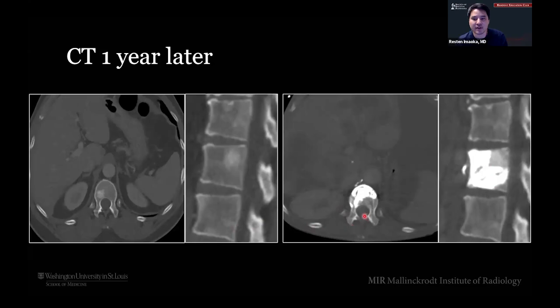So you can see 1 year later, he did absolutely fine. He did not progress at all. It's kind of hard to see through these bone windows, but you can see his liver looks relatively normal here. On this one a year later, his liver looks absolutely terrible with all this widespread metastatic disease. So he progressed everywhere else, except for that area that we treated here.